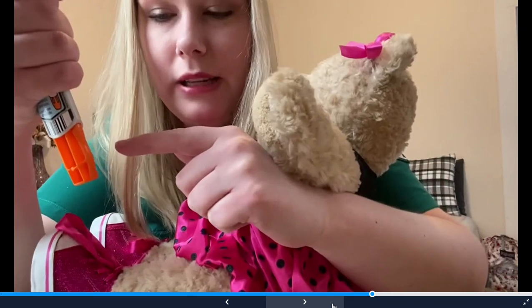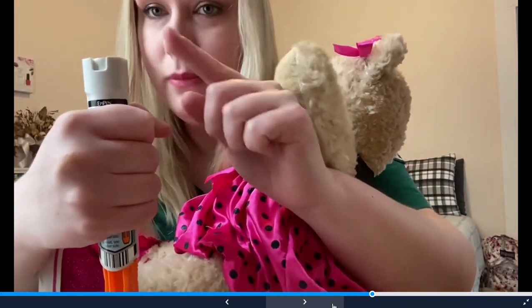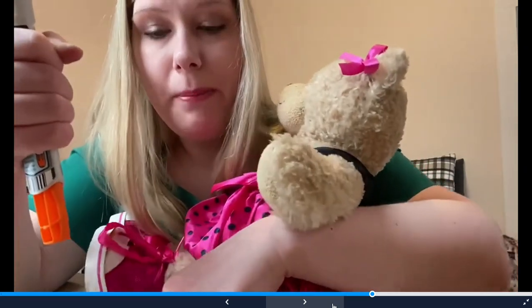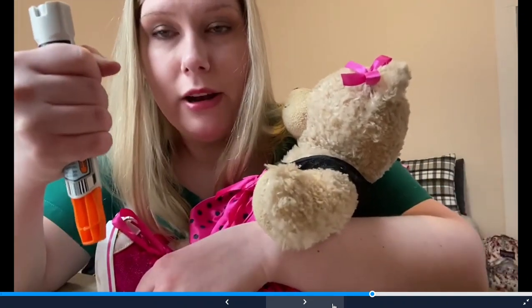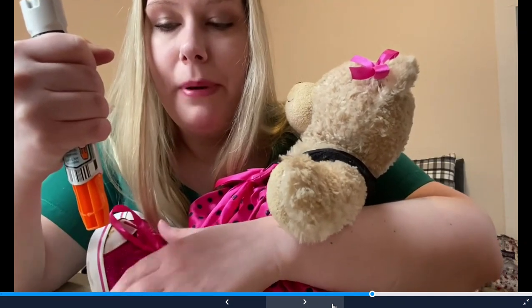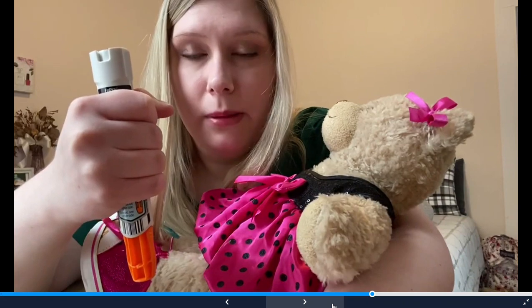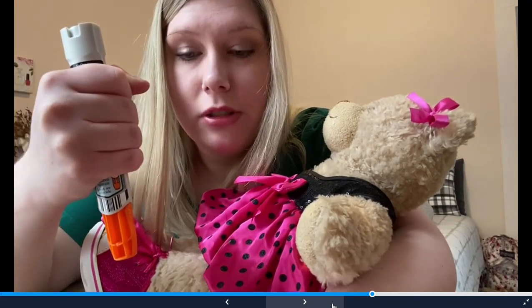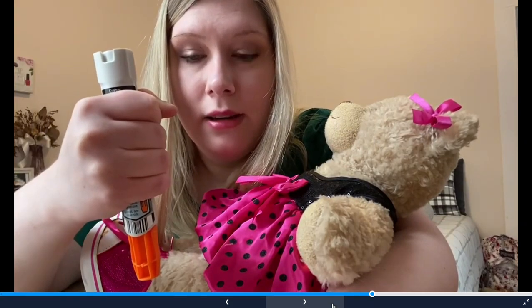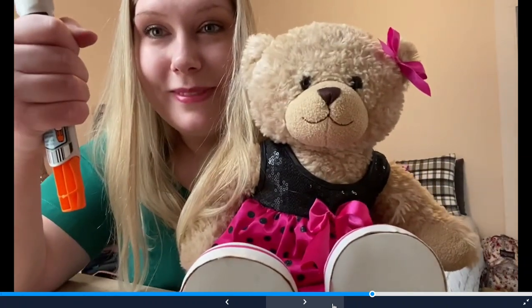See this part? That's where the needle is going to come out. You don't want to touch this or the top, only the middle. After you've used the EpiPen, you're going to put it back inside the case that you took the EpiPen out of. For this, I don't have the case because this is only a trainer. But in real life, you'll put it inside the case until the ambulance comes. When the ambulance comes to pick up your friend so she can go to the hospital, you are going to give them the EpiPen.